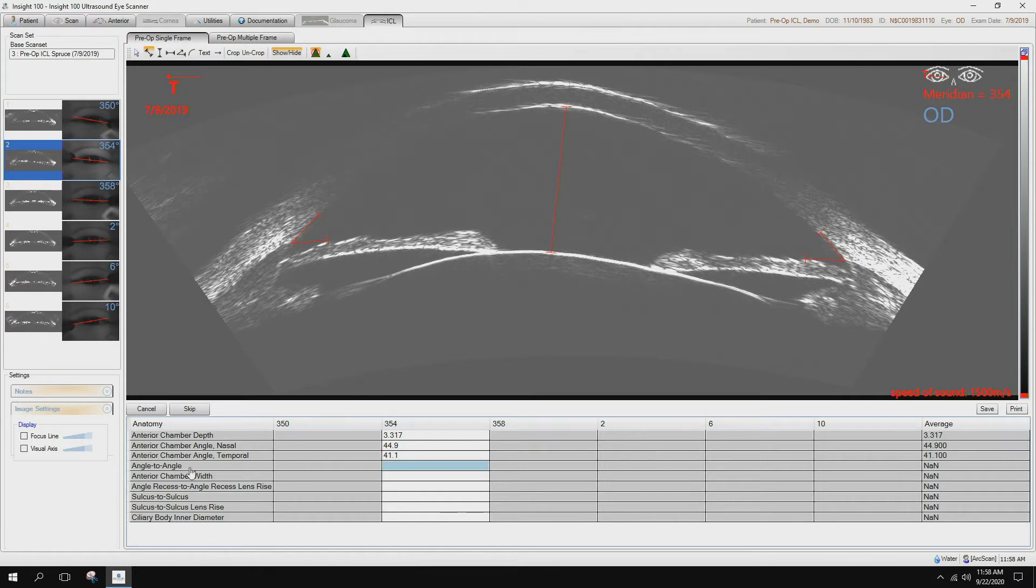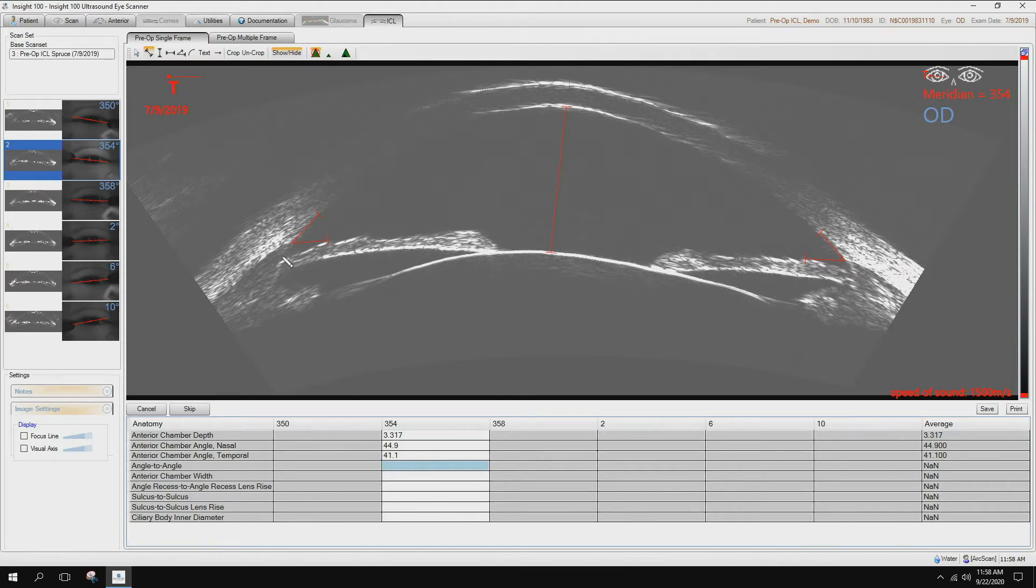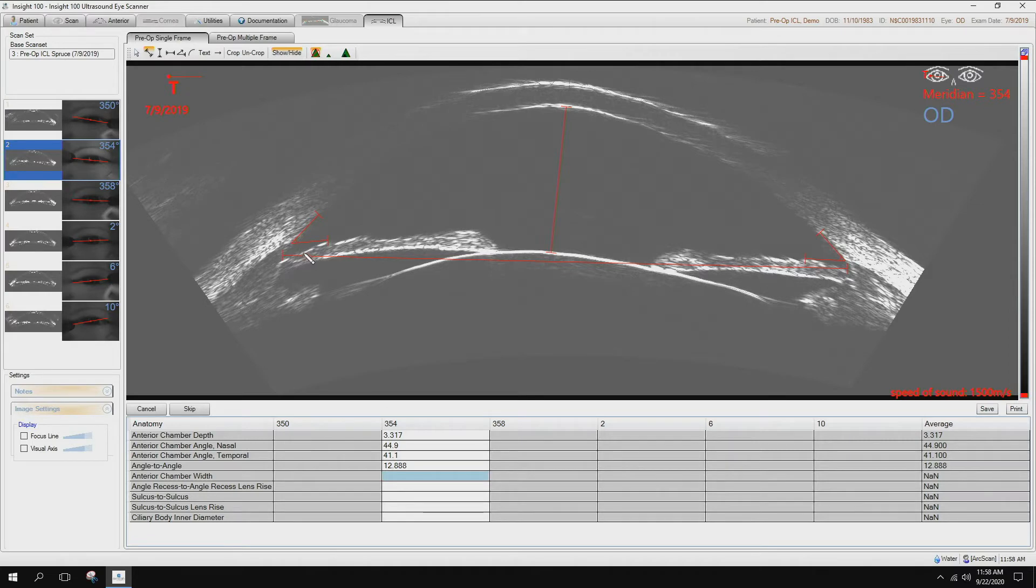Next measurement is angle to angle. This is the angle recess, so it's the farthest recess within the iridocorneal angle. Next one is anterior chamber width. That is defined by scleral spur to scleral spur.